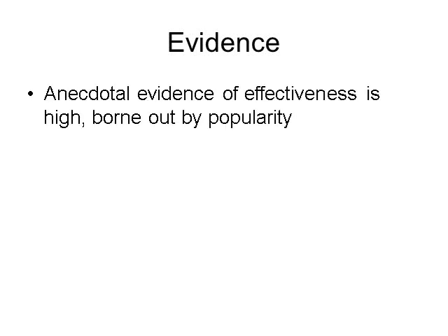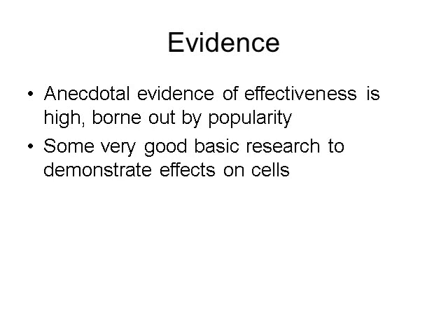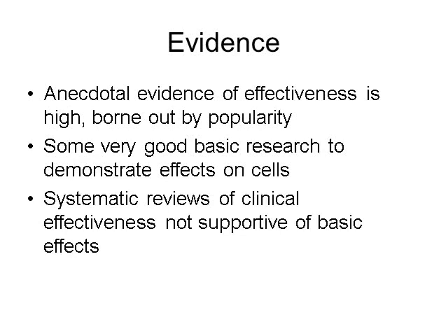As already touched upon, ultrasound is by far the most popular electrophysical modality used by physiotherapists, and there is strong anecdotal evidence for its effectiveness. This anecdotal evidence has to some extent been borne out in the basic laboratory research on cell cultures and animals. The systematic reviews of clinical trials of ultrasound, however, are less supportive, revealing little evidence for the use of ultrasound in conditions such as ankle ligament injuries.